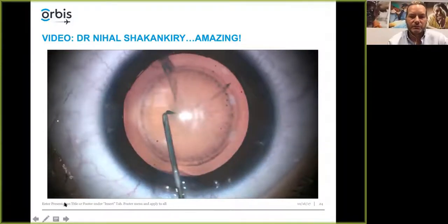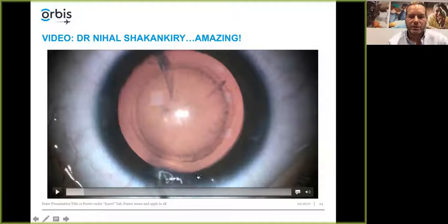Now I'll pause for a second, because you could conceivably not do the implant incision here. You could just later on open up one of your MVR blade incisions, because if you have these small injectable IOLs, the incision's small enough not to induce much cylinder, maybe half a diopter. However, if you don't have a small incision capsulorhexis forceps, or if you don't have a vitrector to do a vitrectorhexis, then going ahead and making your IOL implant and capsulotomy incision now is a good idea, while you've got the eye firm.